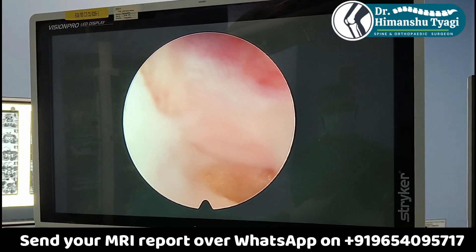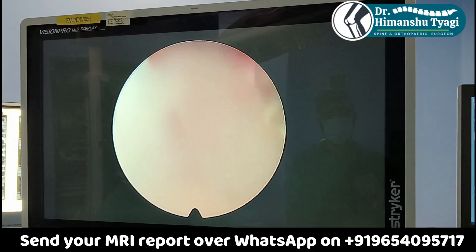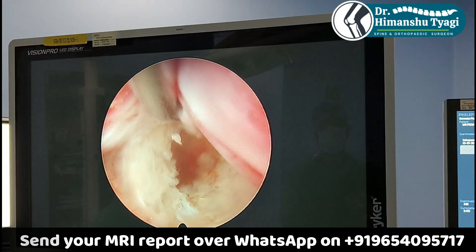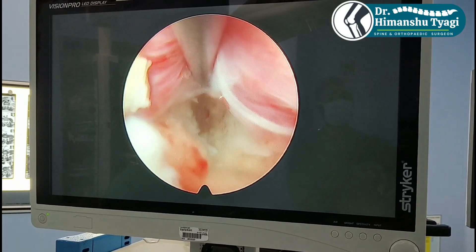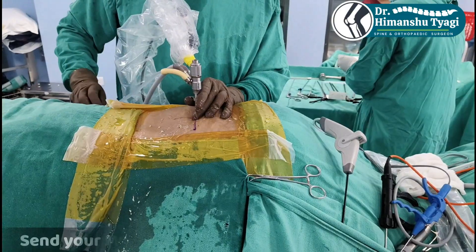Before we end the surgery we make sure that the nerve is totally free, so we check it again. Here you can see that by putting this hook we are able to retract the nerve root freely and there is no disc fragment left to press the nerve root. Everything looks satisfactory and the nerve is totally free.